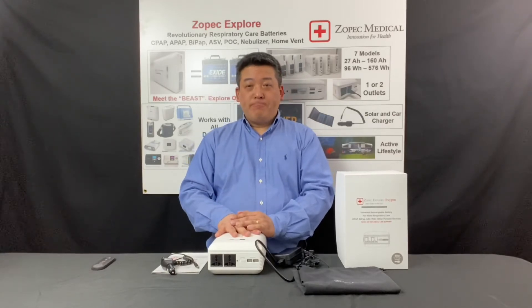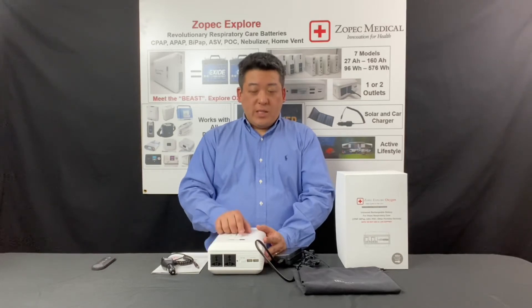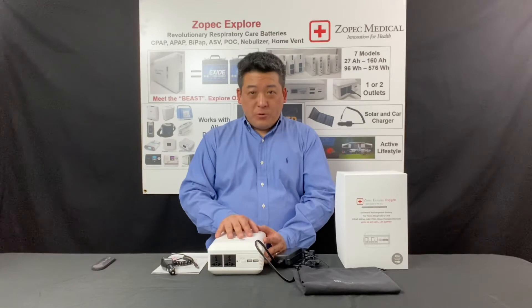When it's fully charged at 100%, it will indicate on the capacity counter 'FF', which stands for full.